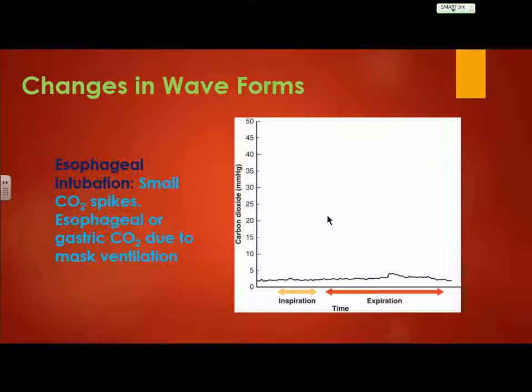What about an esophageal intubation? Well, the first thing that you're not going to expect is what? CO2. What if they just chug down that Coke Zero there? Might be a little bit, but it's going to be an artifacty baseline, and it ain't going to be much. There might be a little residual CO2 in there, but it ain't going to be much. But the key here is that you've got to have that waveform, all right?